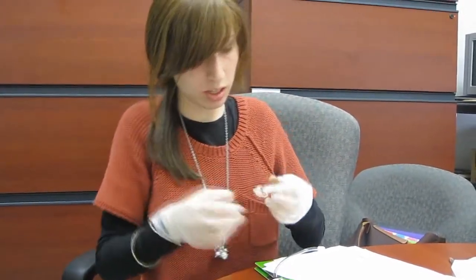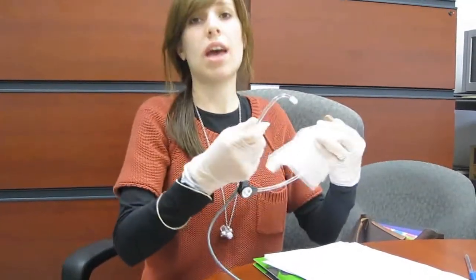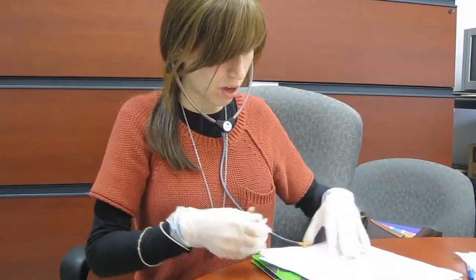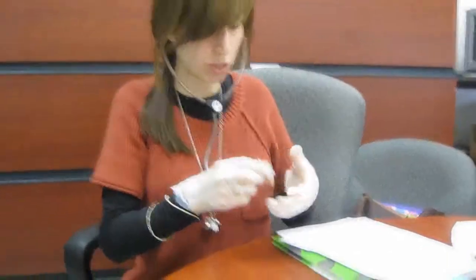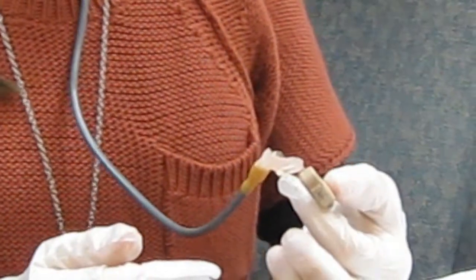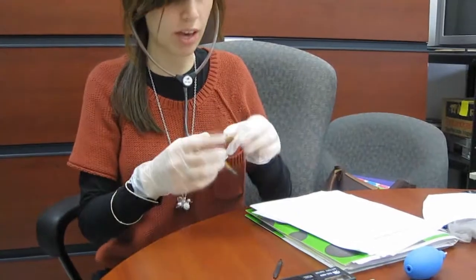And close this. Again, we're going to wipe this, and we're going to check for the 6 Ling sound. We're going to connect it over here. I'm going to make sure that it's on. Yes, I hear myself very loudly. And I'm going to say the 6 Ling sounds. Oo, ah, ee, s, sh, mm. Okay, I hear all of them.